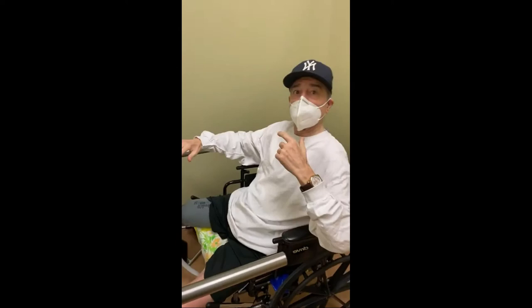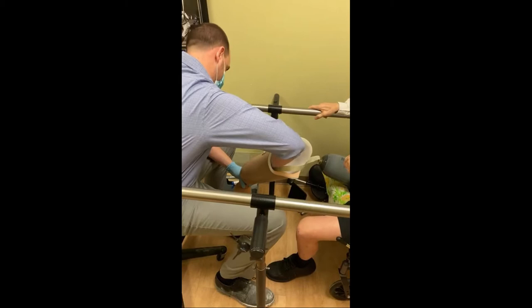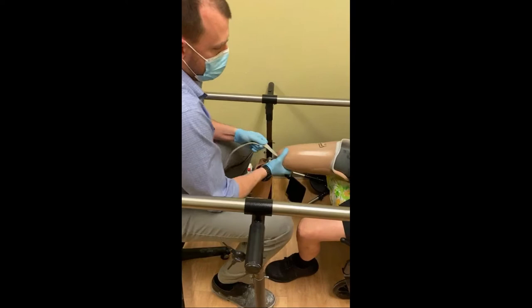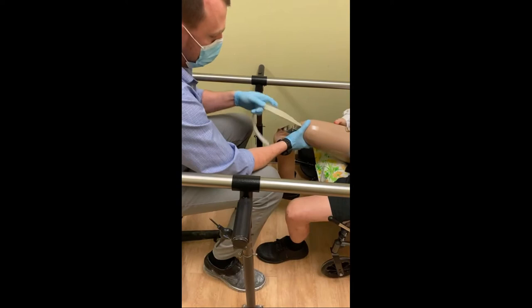Do you see me? Okay, so go ahead. What you're going to do is we're going to attach the leg. I'm attaching the leg. So what's going on here is it's being attached to the gel liner. The gel liner provides suspension and also protects the skin from the hard plastic of the socket.